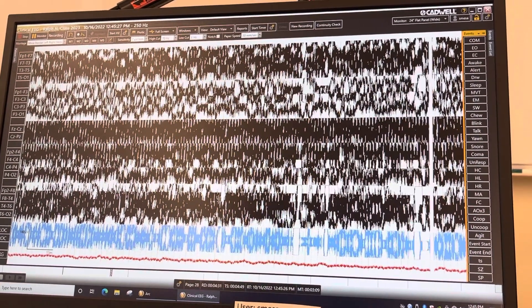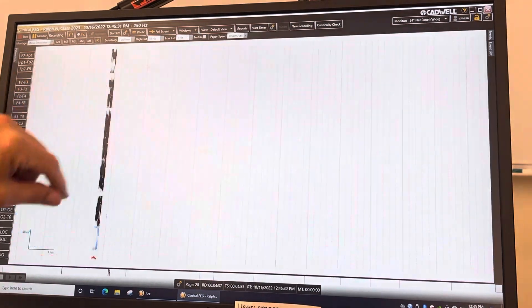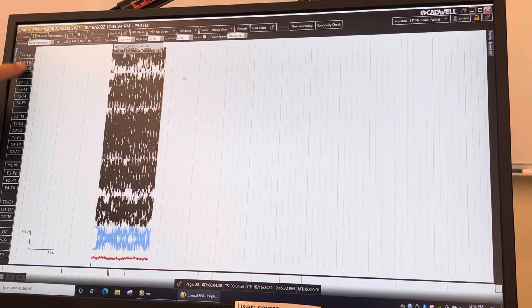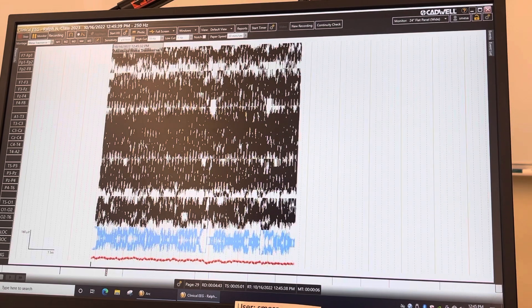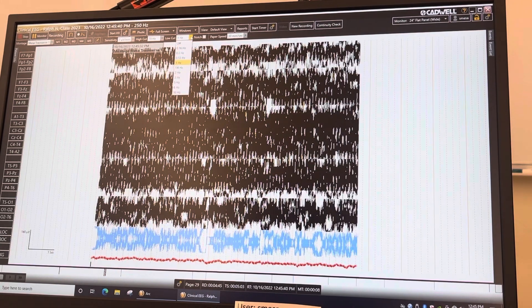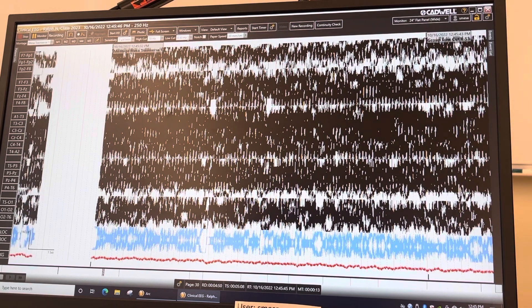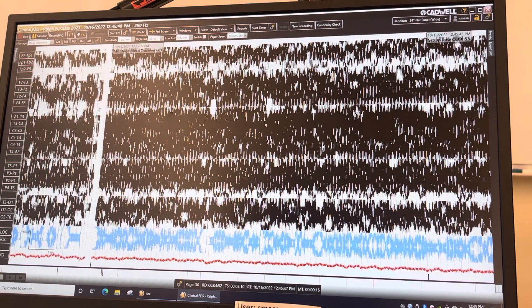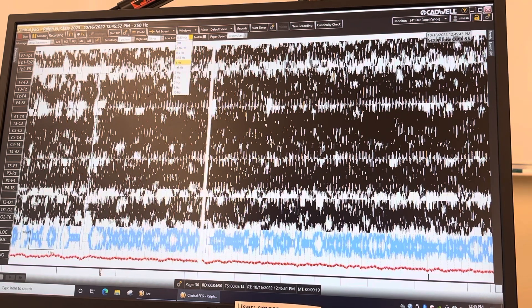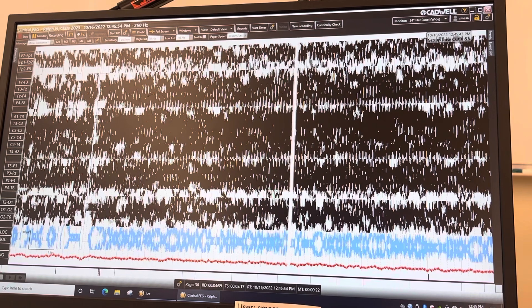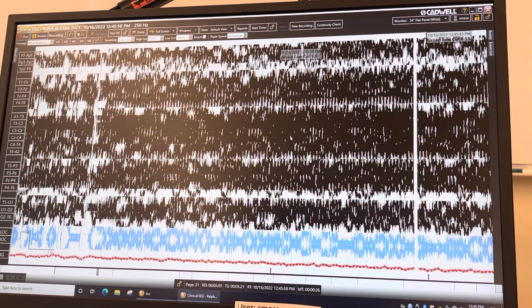Click M3 to bring up the transverse bipolar montage. Go to the low cut filter — if you turn it down to 0.53 it will increase the amplitude of slow waves. Then increase it from 1 to 1.6 and it will decrease the amplitude of slow waves.